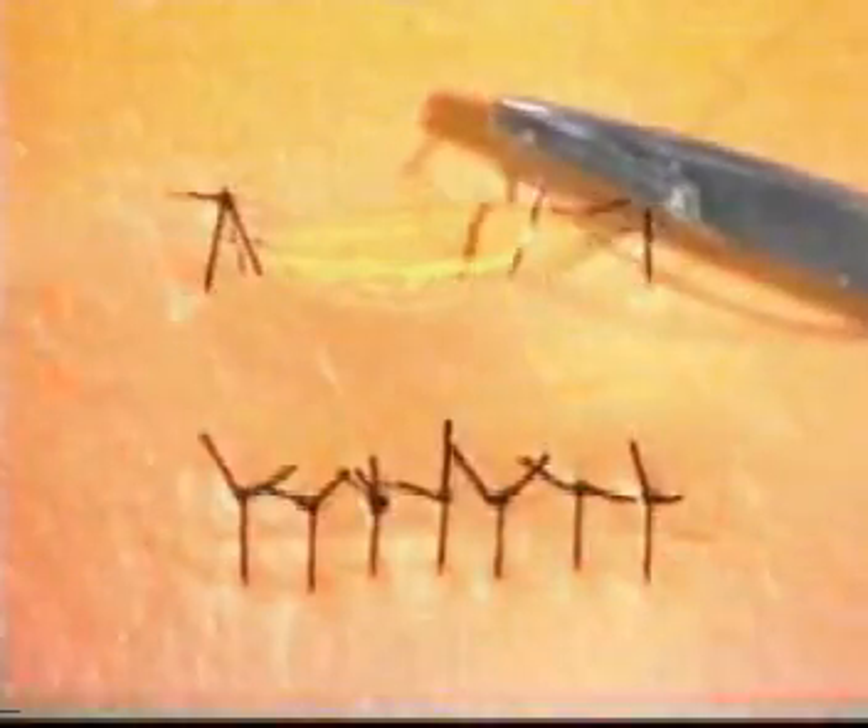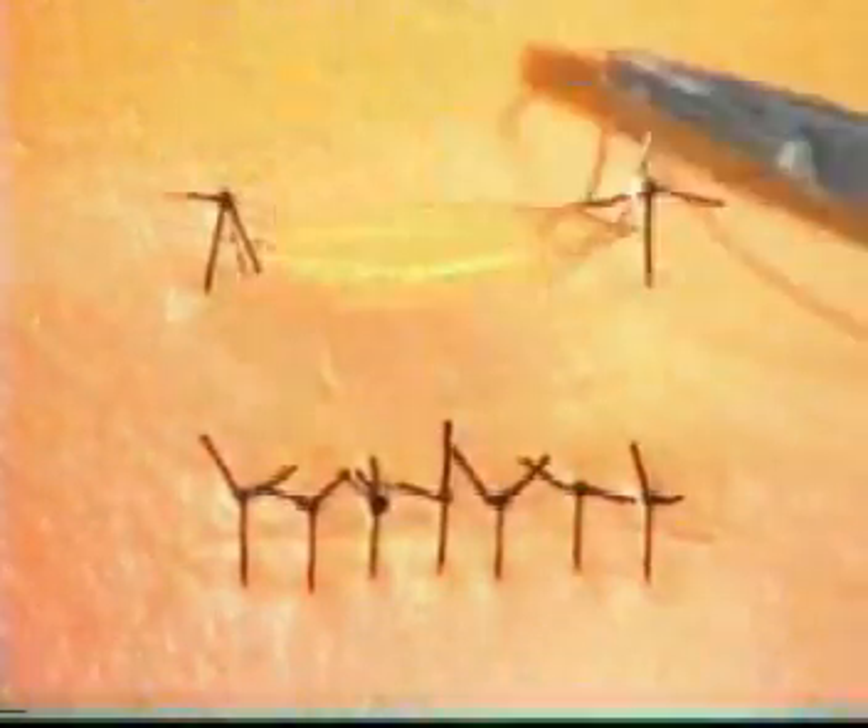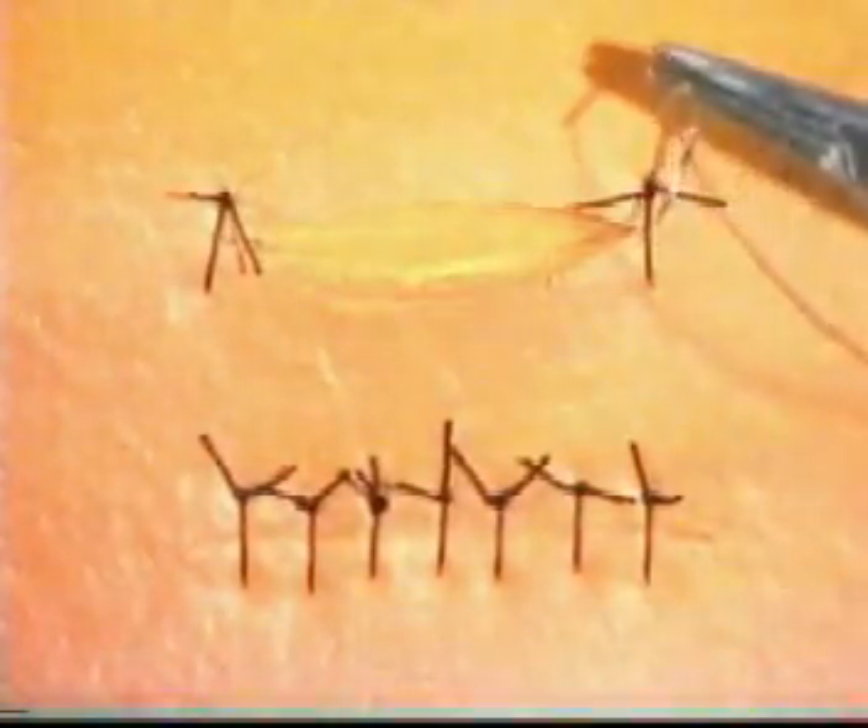You are now in a position to continue to close this ellipse, working from each end alternately, inserting interrupted sutures. This makes for a most satisfactory result.